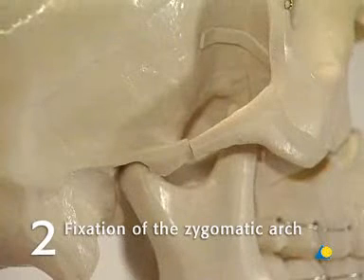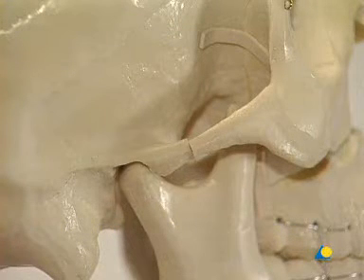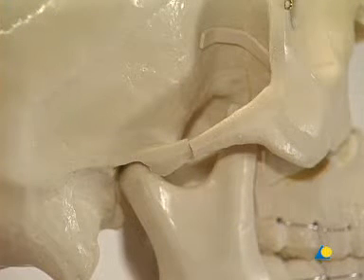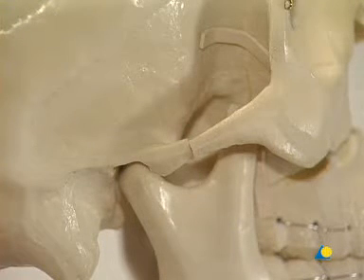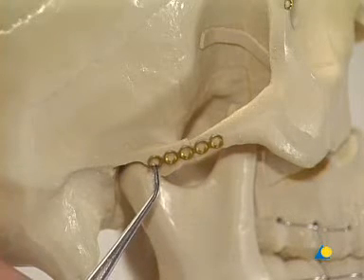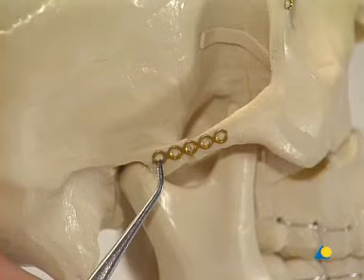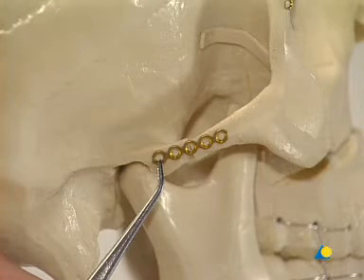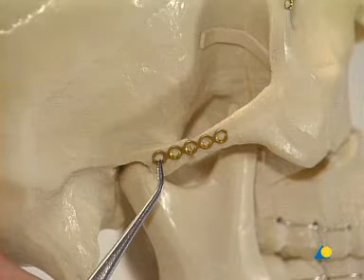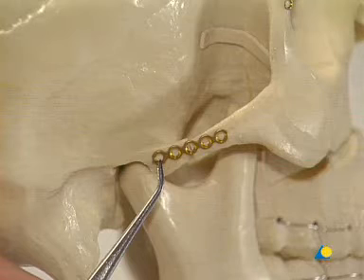Fixation of the zygomatic arch. The next step is fixation of the zygomatic arch, which is essential to establish the correct anterior-posterior projection and width of the face. A straight 5-hole 1.5 adaption plate is used for this simple fracture; however, the zygomatic arch is often comminuted, which would require a longer plate. Due to the anatomical form of the arch, pre-bending of the plate is usually not necessary.